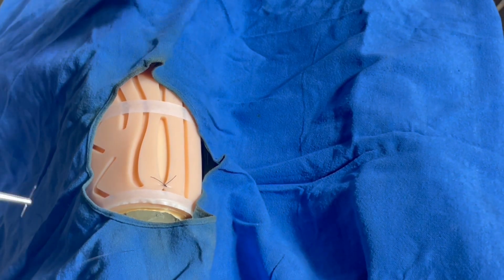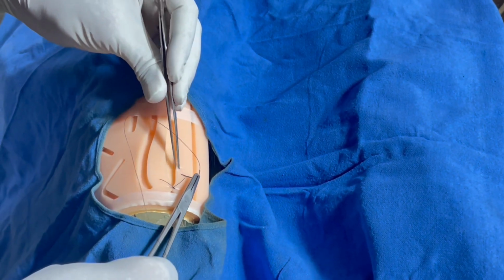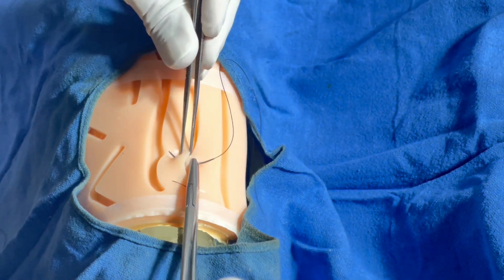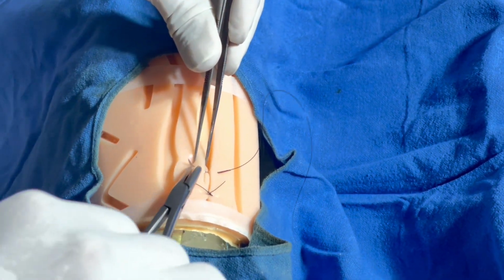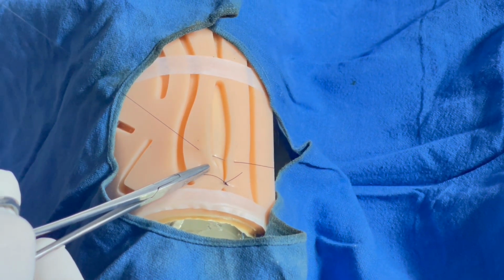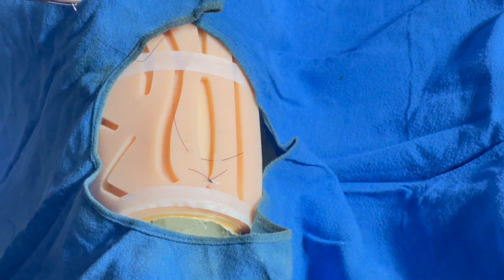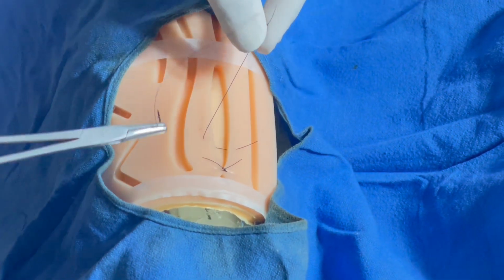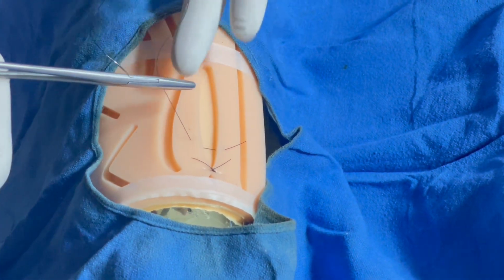As the needle is very short, I am just trying to secure the needle. These are the stitches, simple stitches. If I got a long length, it will be easy. Otherwise, I will secure this needle into the pad.